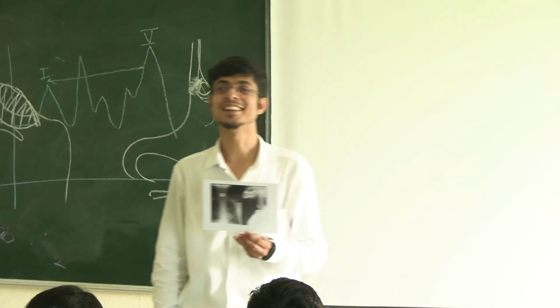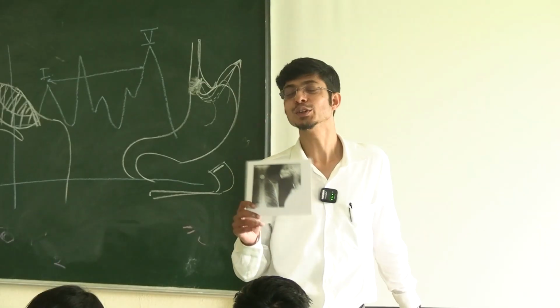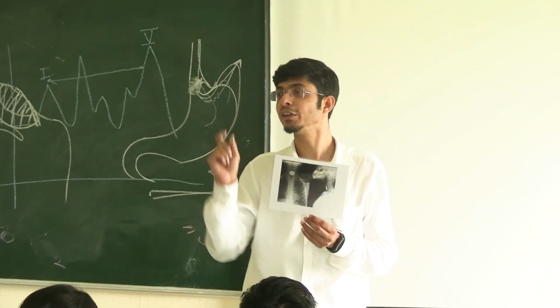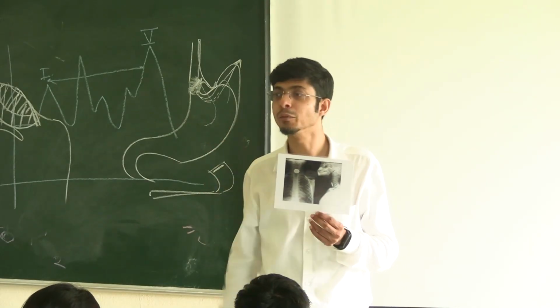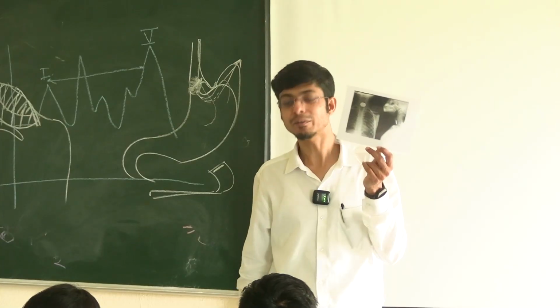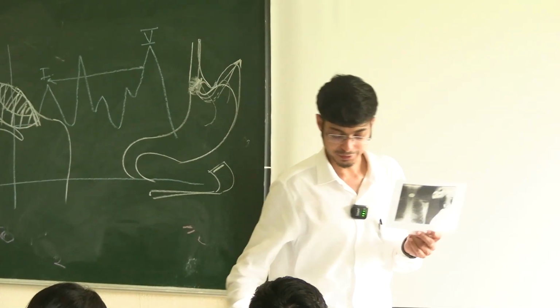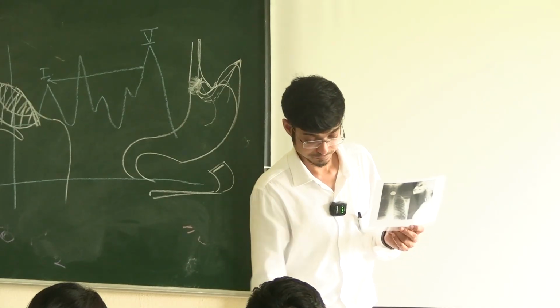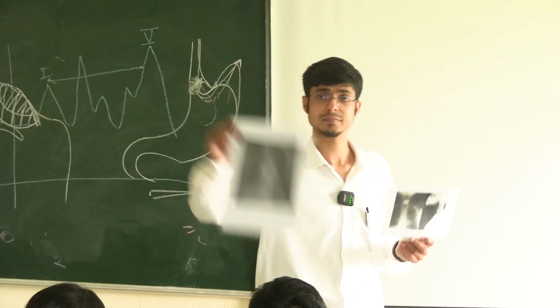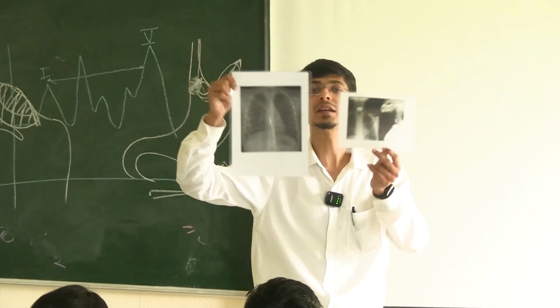Yes, very good. Actually, that's not how you say it. That's right, actually, but you don't say it like that. So what they want to know is the relative position or relative orientation of the foreign body. Okay. So what would the shadow have been like if the foreign body was in the trachea? You understand the difference between these two?